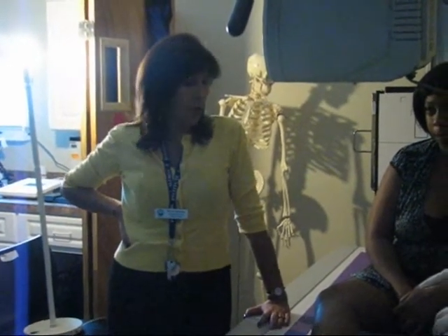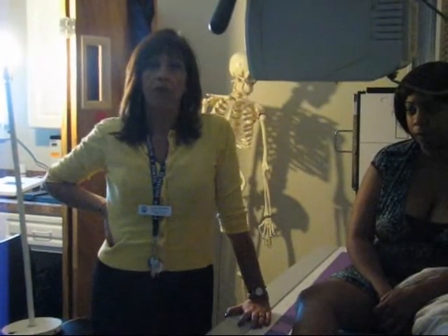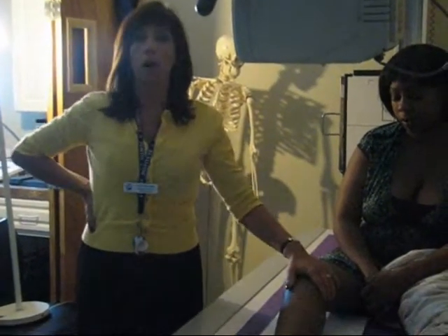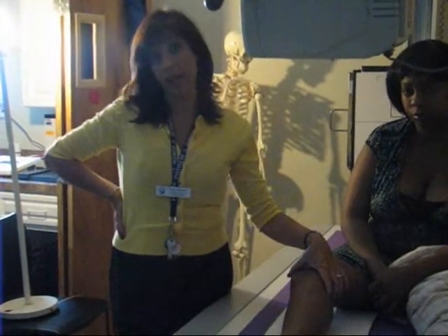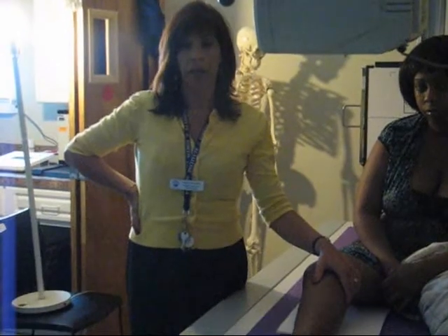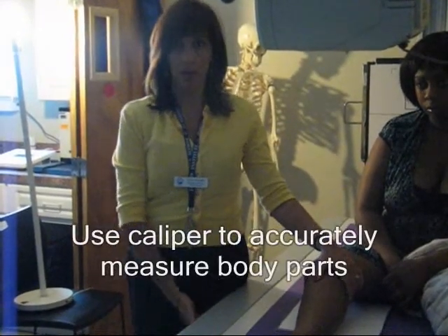For the projections of the knee, I have some special considerations to tell you about. If the knee is larger than 10 centimeters in diameter, in thickness, this projection should be done with the grid, so with the cassette on the bucky.